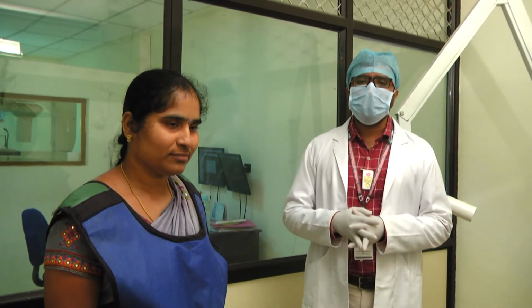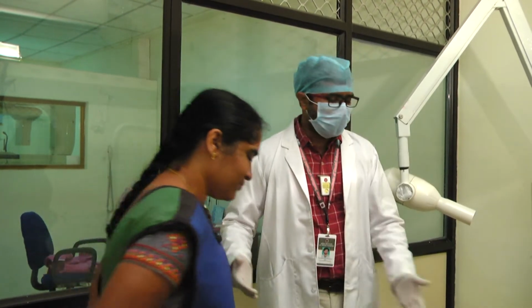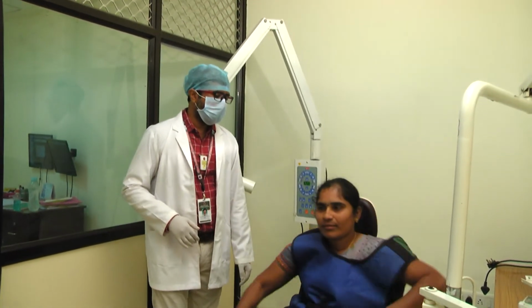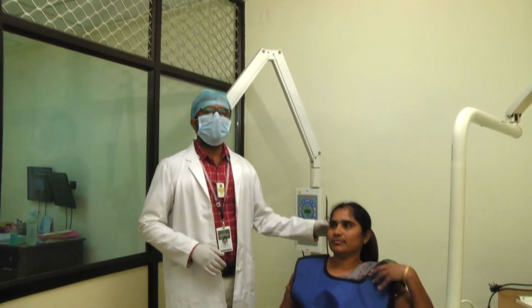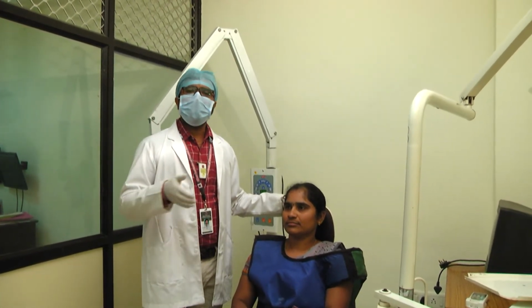Now let us have a demonstration on the patient of the bisecting angle technique and different intraoral projections. Before making an exposure, there are 7 fundamental rules or steps to be followed. Among them, the first step is to greet the patient and make the patient seated.